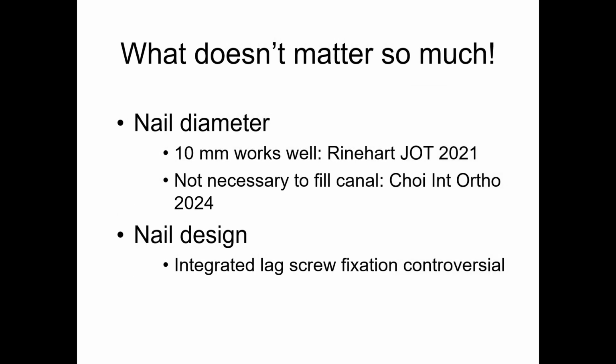I think what doesn't matter so much is nail diameter and nail design. For nail diameter, a 10 millimeter nail works well, and it really isn't necessary to fill the canal with a nail. For nail design, integrated lag screw fixation has been promoted, but outcomes are mixed, and this is still a very controversial topic.